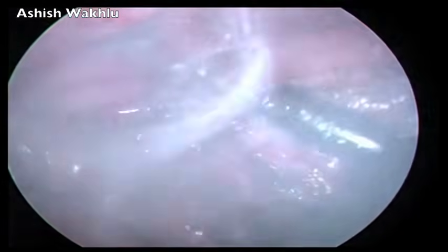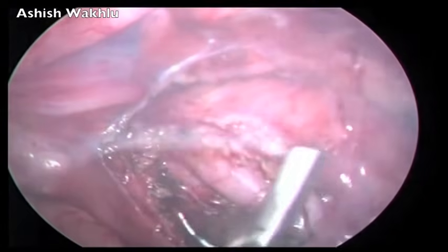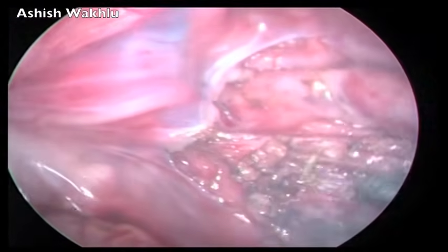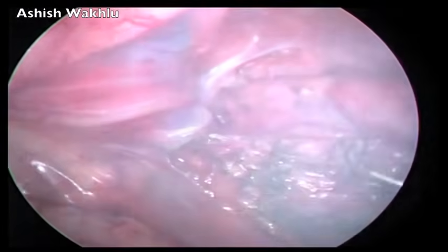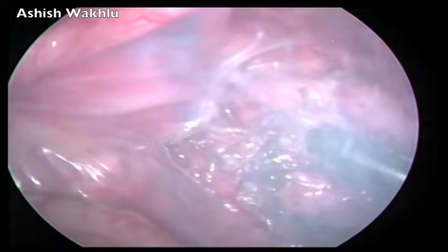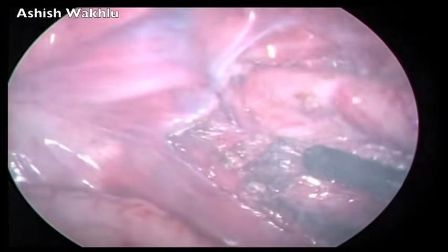Standard laparoscopic dictum has it that you should not cross your hands while using instruments, but it's all about the convenience and the most ergonomic way of providing traction and counter traction on the tissues so that the planes you want to dissect are clearly displayed. If you have to cross your hands sometimes, there's no harm in doing it, so long as your instruments don't battle with each other.